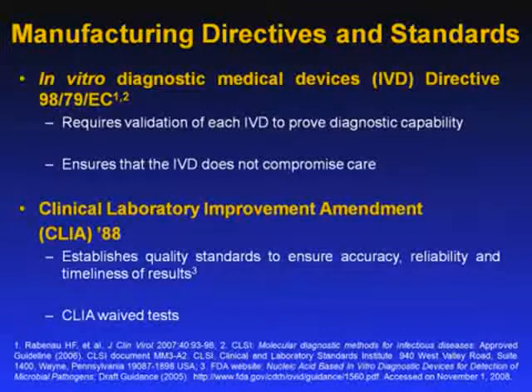The Clinical Laboratory Improvement Amendment, or CLIA 88, mentioned briefly earlier, is required for verification and validation. The amendment was created to establish quality standards for all laboratory testing to ensure accuracy, reliability, and timeliness of test results. Tests can be waived from regulatory oversight if they meet certain requirements established by the CLIA 88 law. Currently, there are more than 100 CLIA waived tests available, not nucleic acid recognition tests, though. Waived tests are important because they are convenient, efficient, and rapid, 3 factors that improve patient care. CLIA regulations must be satisfied before the test result can be used to influence patient care.